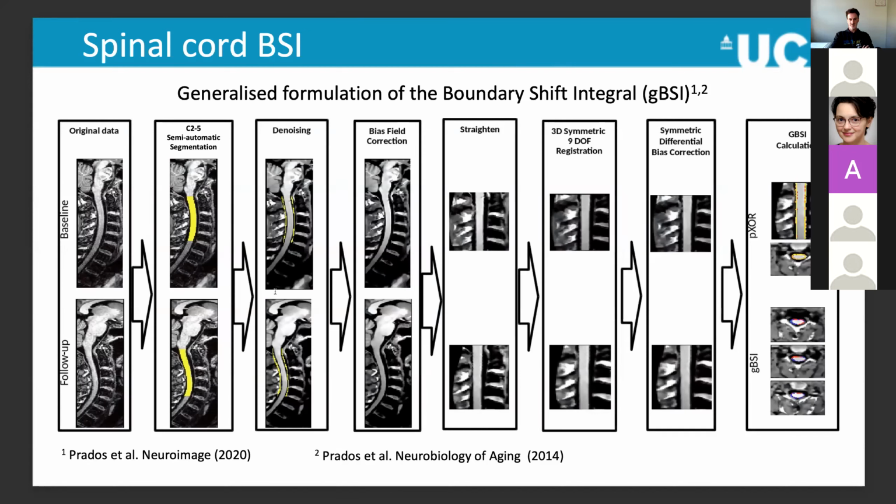Then for this pipeline, I needed to add some priors because this is currently the pipeline that we are using in the trial office for detecting new lesions, but we are also detecting enlarging lesions. As the challenge is focusing on new lesions, I needed to add priors to remove the enlarging lesions.